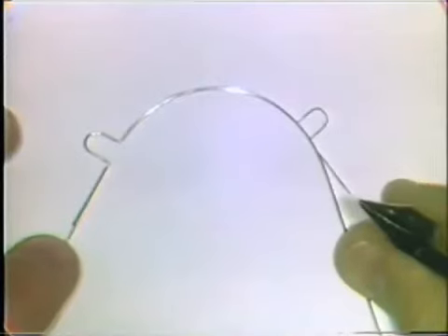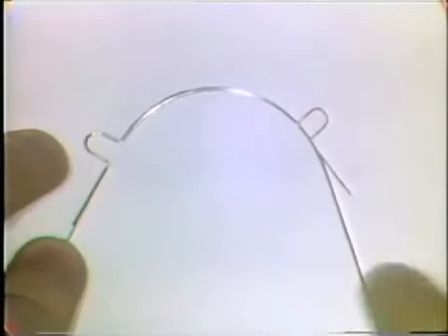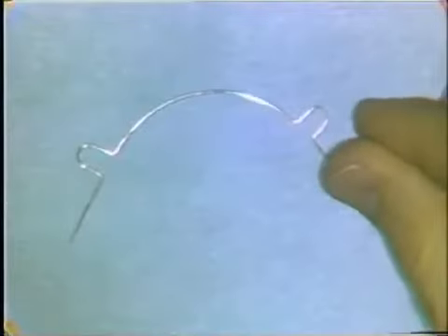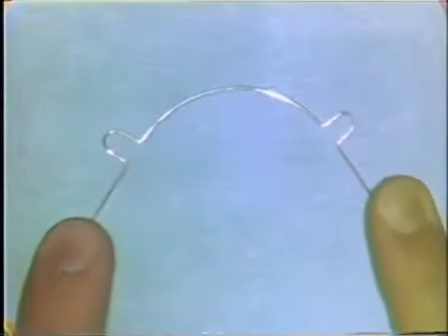The second loop is constructed in exactly the same manner. You start with a mark on the main wire where the first half of the loop is to begin. The completed wire fits exactly over the lines of the pattern, and it is free of nicks and surface defects, and it should be flat on a flat table surface or glass slab.